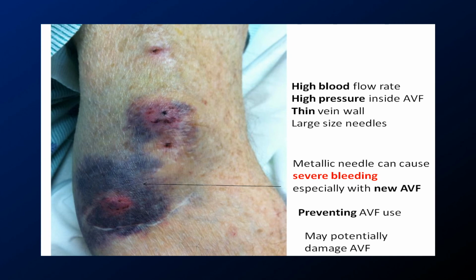The problem is patients dialyze for 4 hours and they cannot move. If they move their arm, the needle pops through the wall and causes severe bleeding. Now, if you have a non-traumatic end of the catheter, hopefully that does not occur. Further clinical trials in real patients will be needed to prove what we are trying to demonstrate today. It does not cause bleeding, and severe bleeding can cause damage to vessels.